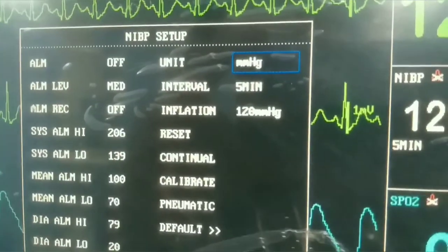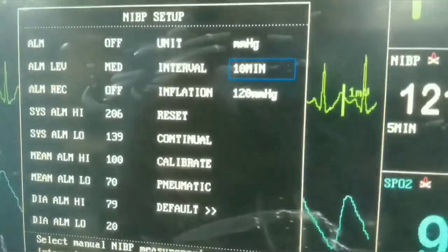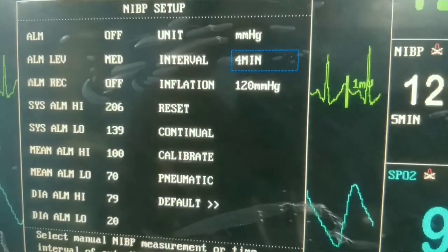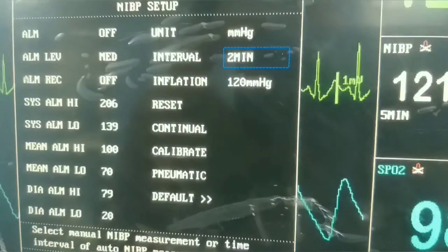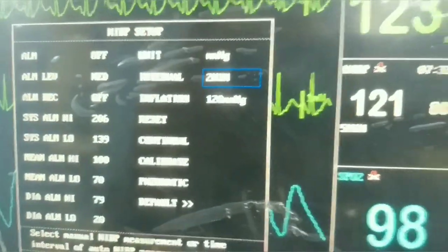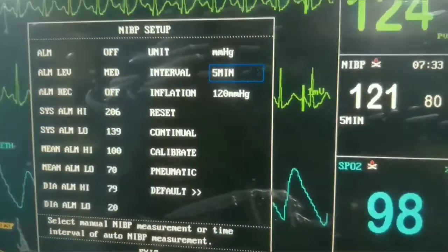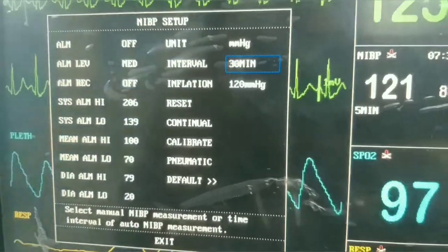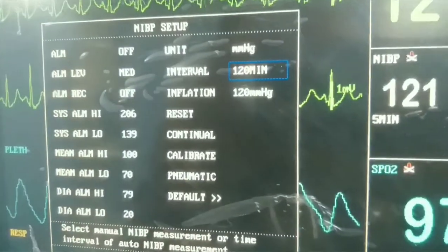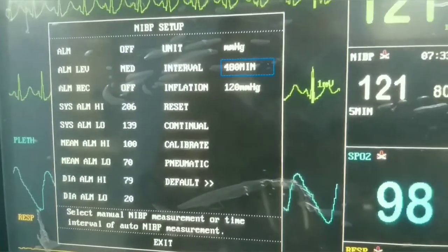We can also set units to kPa, but here we use millimeters of mercury. There is a time adjustment setting — we can make it manual or automatic. Manual requires pushing every time to inflate the cuff, while automatic inflates the cuff at intervals ranging from one minute up to 480 minutes.